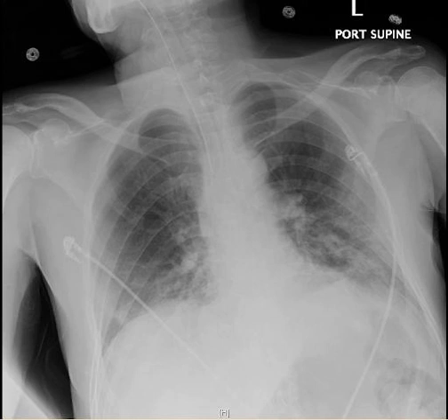The interesting thing about CT scans is in some patients, you can actually have CT scan findings of ground glass opacification before patients actually develop really significant symptoms or disease from coronavirus. In China, they did a study where they CT'd healthcare workers who were just exposed to COVID, but didn't have any symptoms. And 14 out of 15 of them had actual ground glass findings on their CT scanning. So very interesting.